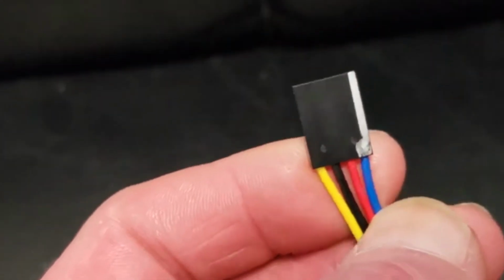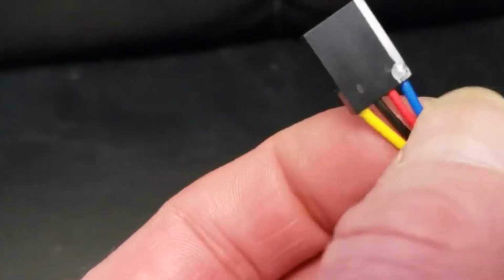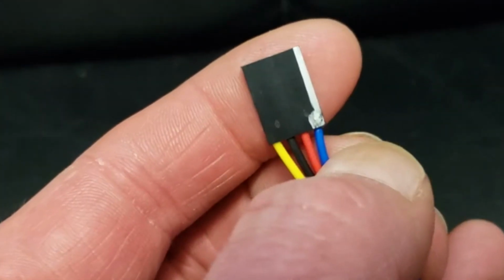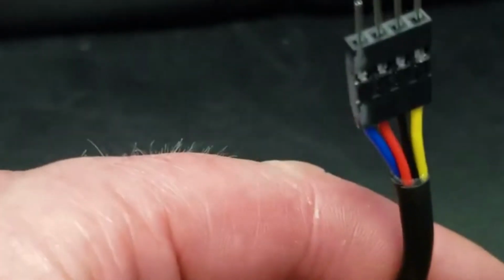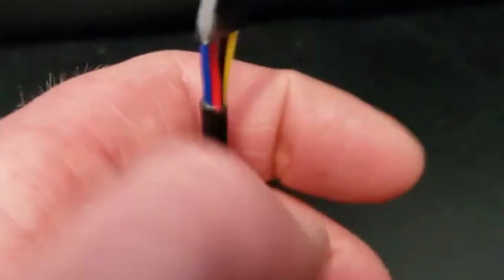So what I'm going to do is open up the Panorex machine and look and see the existing wire that's there now. Let's suppose, for argument's sake, on the right hand side it's brown. So I'll plug it in like this with the blue on the right, and then I'll make sure that it goes on the female, on the other side, the male connector. Whatever's going into the brown end on the motor, I'll put the same blue end into the motor there. Hope I'm being clear, and let's see how this works.